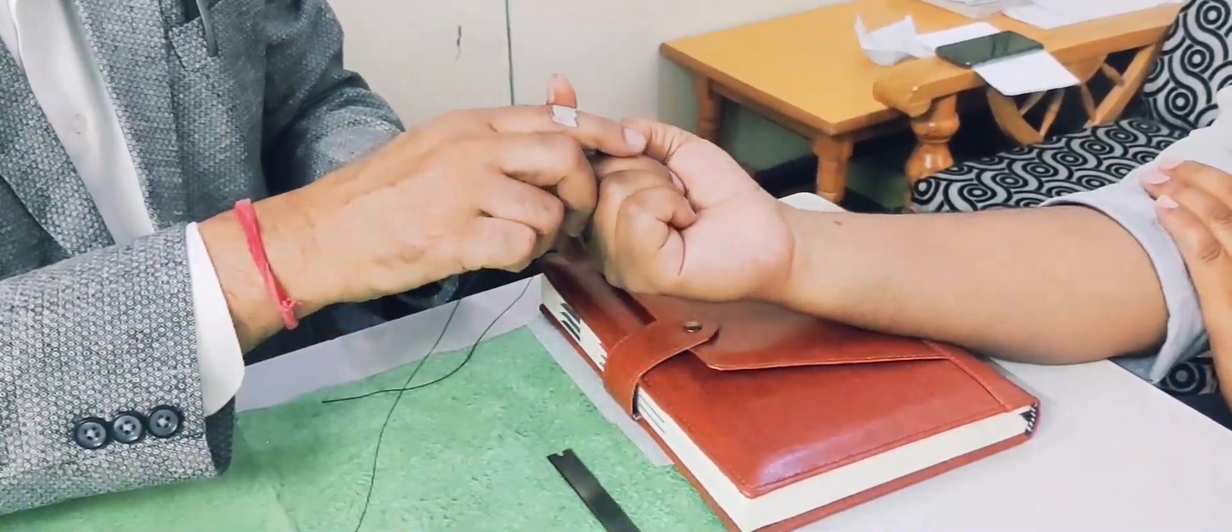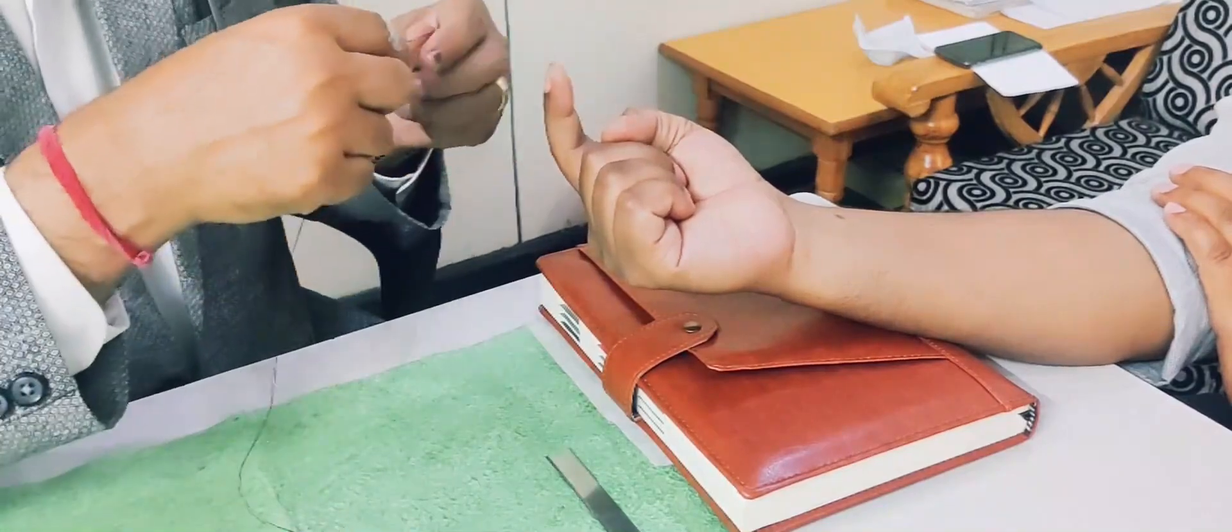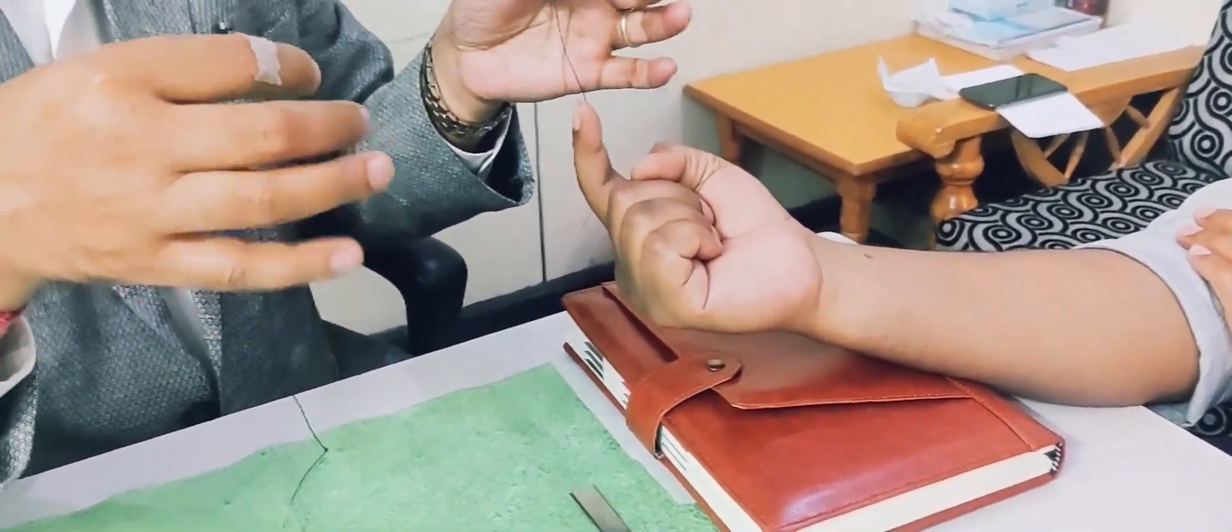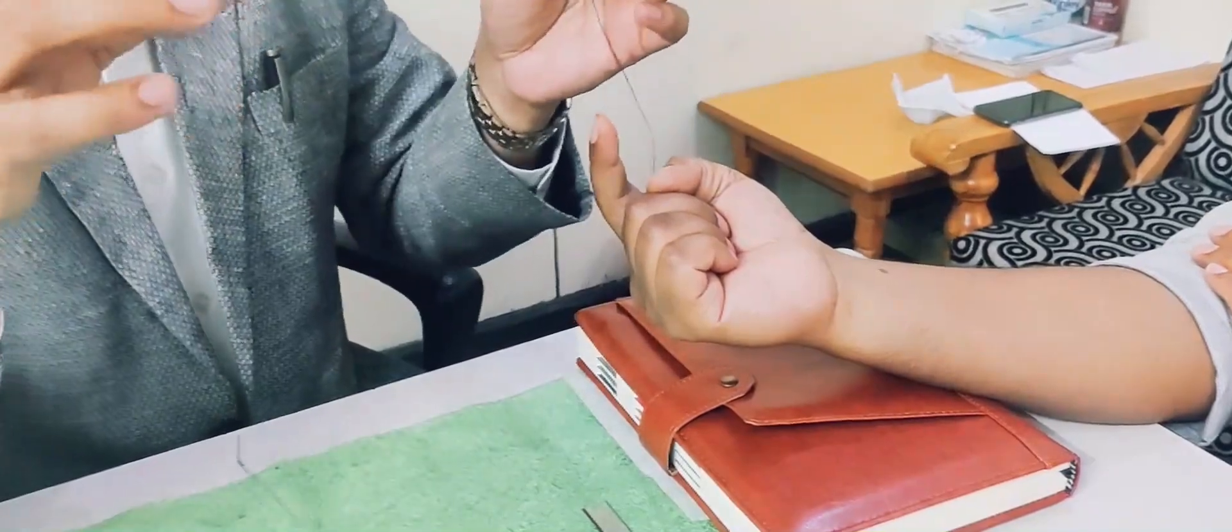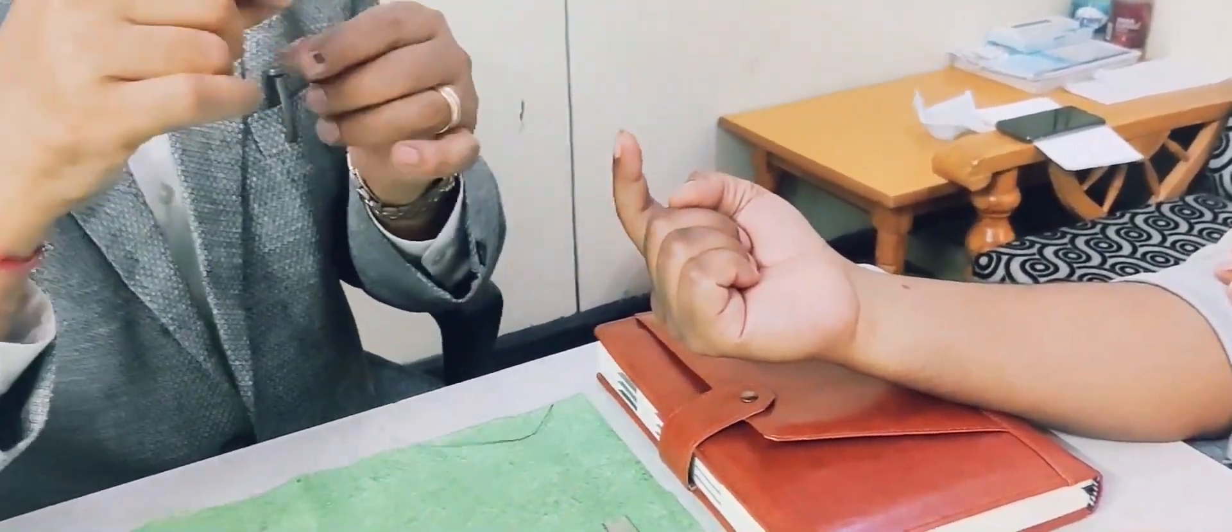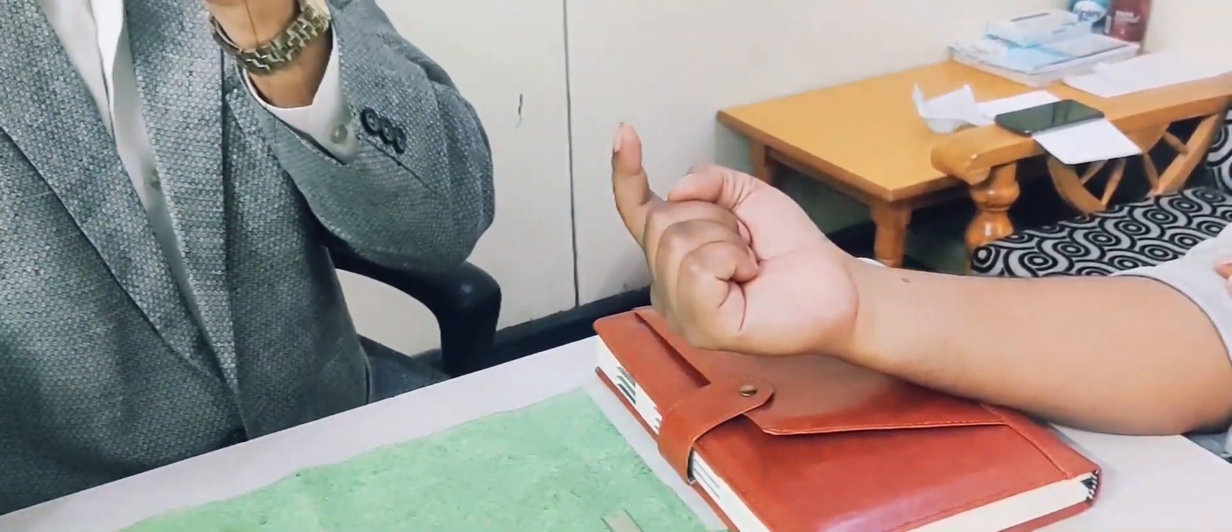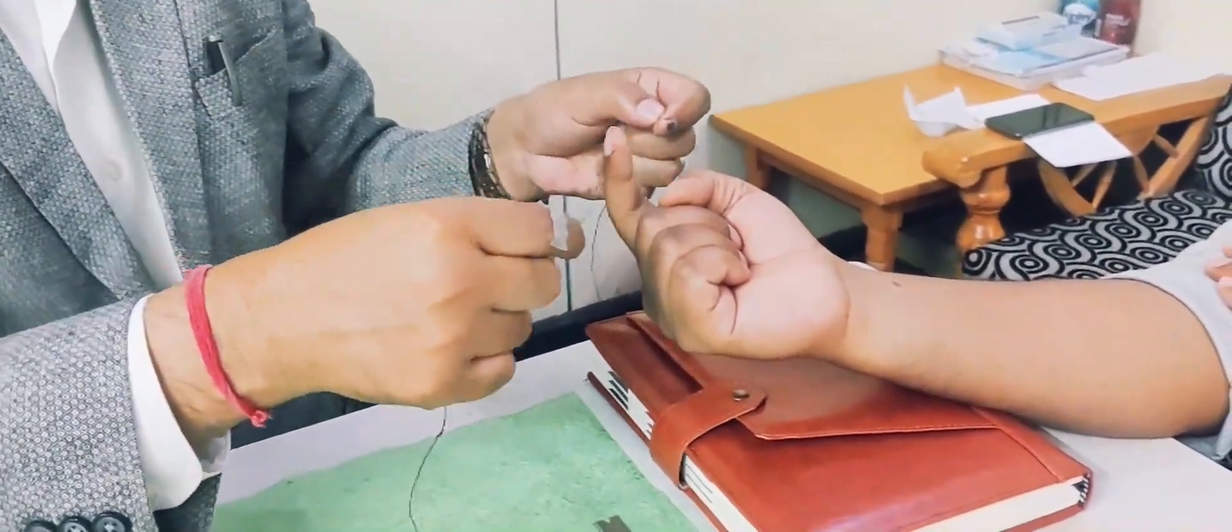So you will ask your assistant to show a finger like this, and now you are going to hold the thread. And here you have to remember that right hand thread, right hand silk, should be smaller than your left hand.